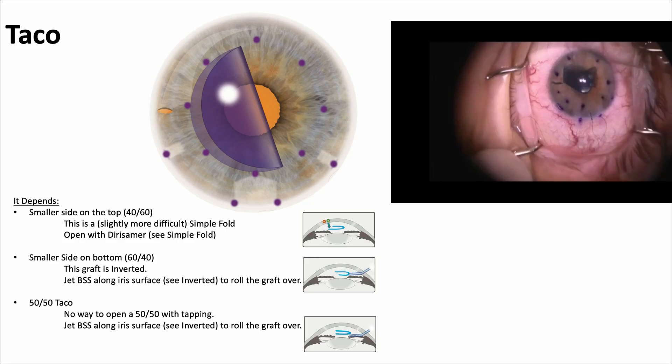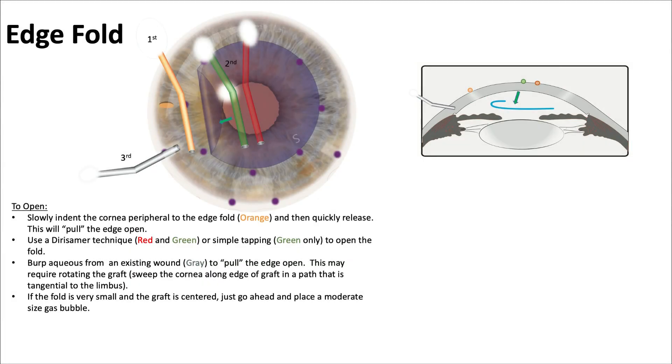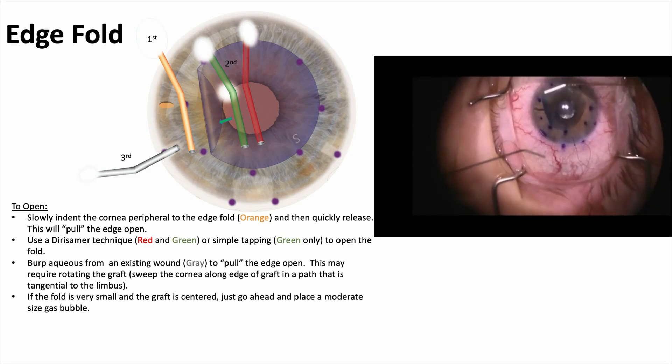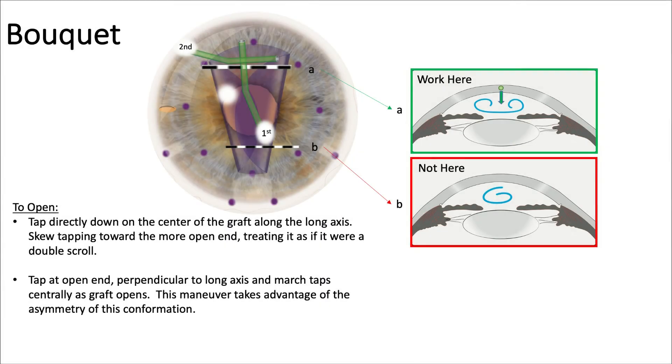If the smaller side is on the bottom, the graft may be inverted — jet some BSS along it. A 50/50 taco is very difficult to open. A fluid wave is sent across and gentle tapping with the Dirisamer technique helps open it and unroll the graft. For an edge fold, slowly indent the cornea peripheral to the edge, then quickly release using the Dirisamer technique. Tapping with the green cannula and burping aqueous from an existing wound allows fluid to exit. A moderate gas bubble may also center the graft.